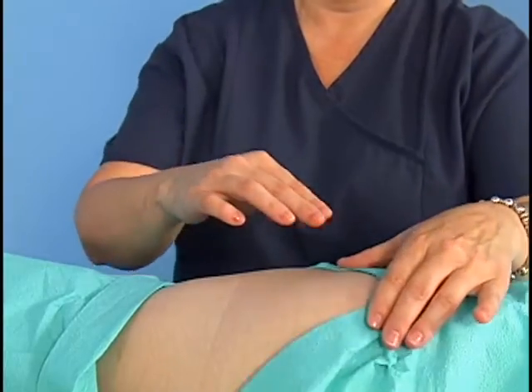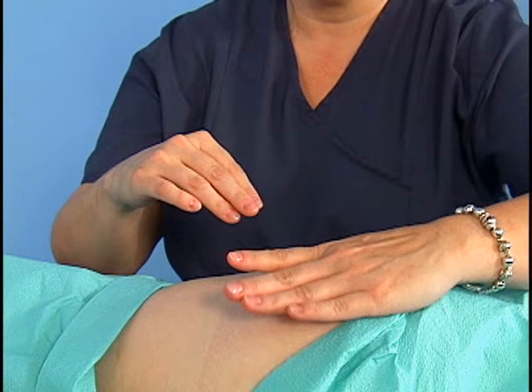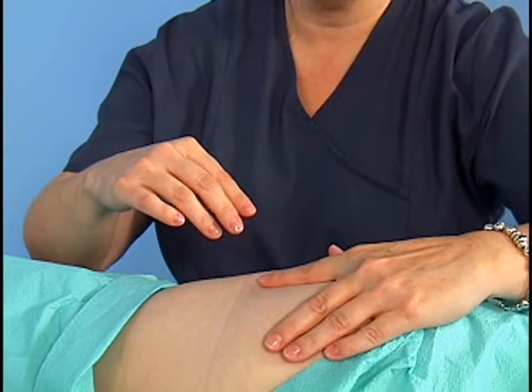If injecting into the patient's left side, place the palm of your right hand on the greater trochanter and your index finger on the anterior superior iliac spine. Spread your middle finger posteriorly as far as possible away from the index finger to touch the iliac crest. Reverse the hand position for the other side. The triangle formed by your fingers is the injection site.